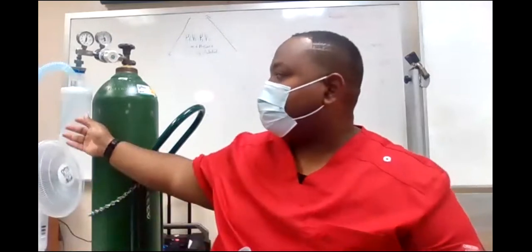Aerosol face mask, aerosol trach collar, aerosol face tent, or aerosol T-piece. So what's the water called again? Aerosol. No, this is the large volume nebulizer, because it nebulizes water. Aerosol, you can see. Humidity, you cannot see. We'll learn that when you get to aerosol humidity, which I think is coming up after this section. We're going to talk about the importance of the humidity and what happens if you don't humidify air. But for this test and this unit, we don't get deep into the humidity right now. I'm just showing you that this is an aerosol setup, which is a high flow system.